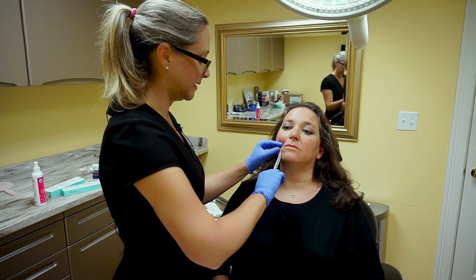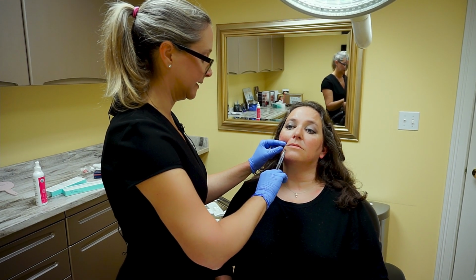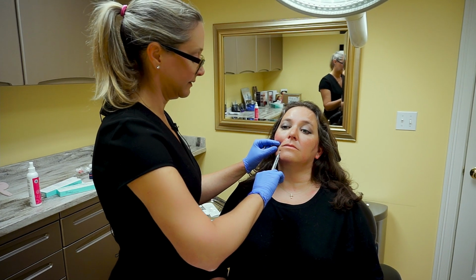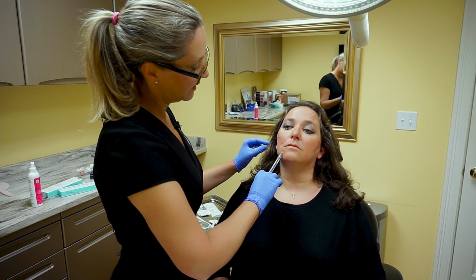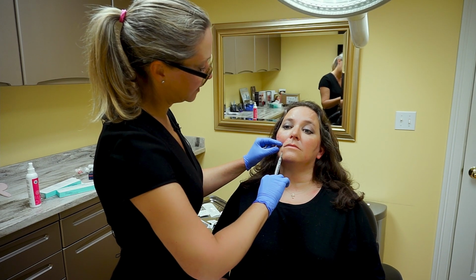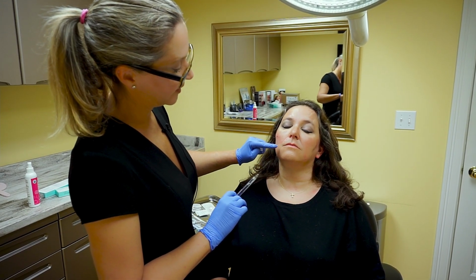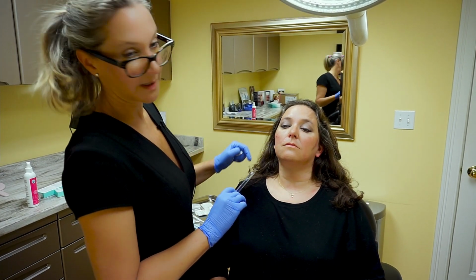If I inject into around the lip, I could get the lateral lip to turn up a little bit. You could see it fill in so that she doesn't have a line forming. This will be some prevention as well as fixing. But you could see now that that side of her lip turns up and that side of her lip is turning down.